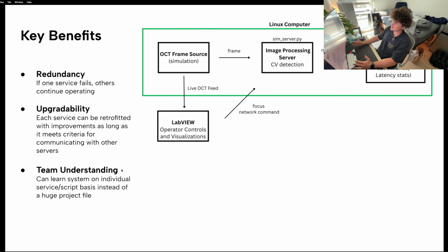And so the key benefit of this architecture is redundancy. If one service isn't behaving right, we don't necessarily have to look through one whole program and wonder what isn't working the way it should. Everything being split into its own service means that we can focus on just that service, since each of these services works off of a series of inputs and outputs. As long as these inputs are processed the way they should be and the outputs are what's expected, we know that we're doing something right. It's great for redundancy, great for upgradability as well. More than likely, we'll have to improve the computer vision from the image processing server as we continue to test.